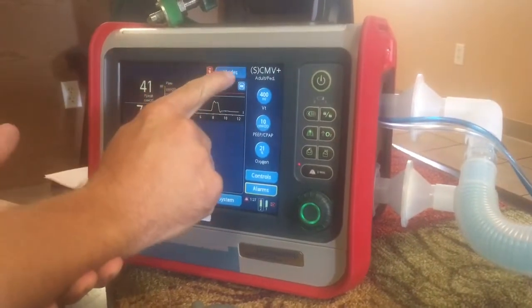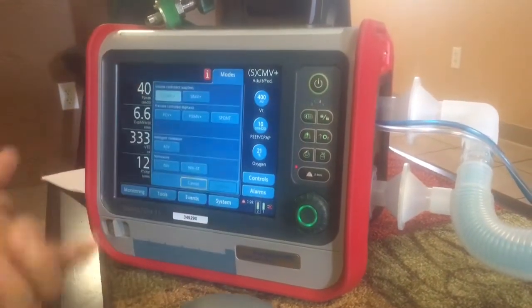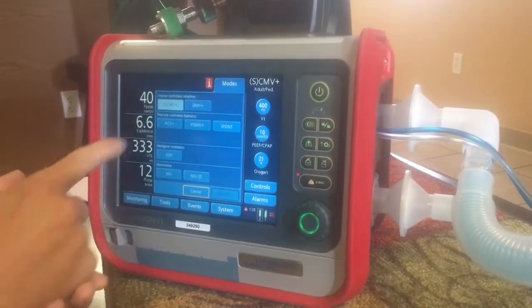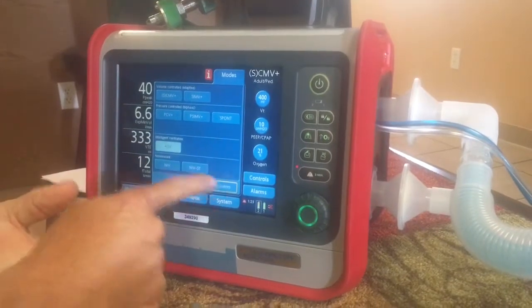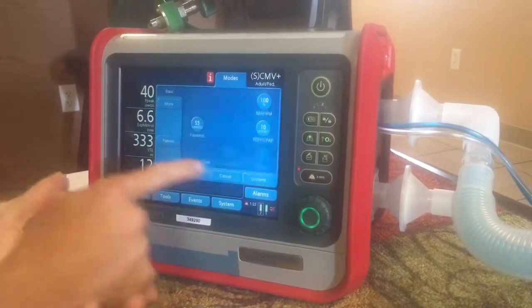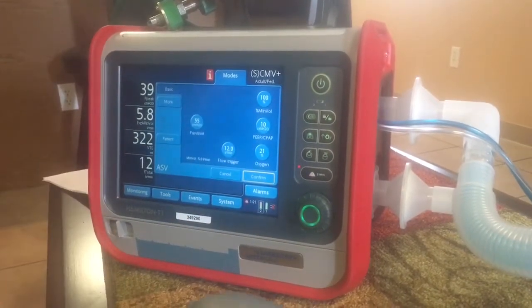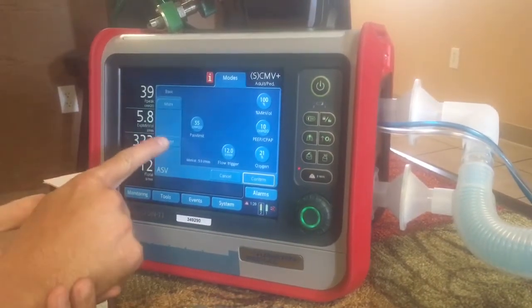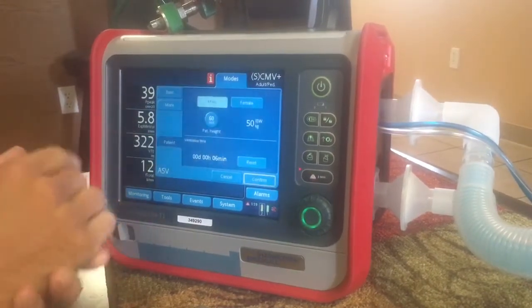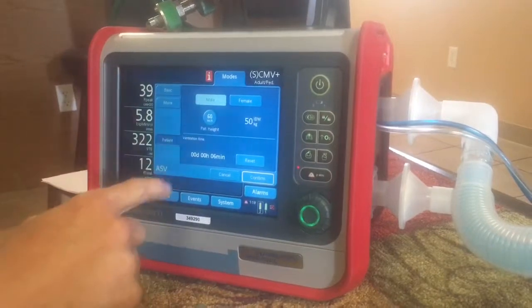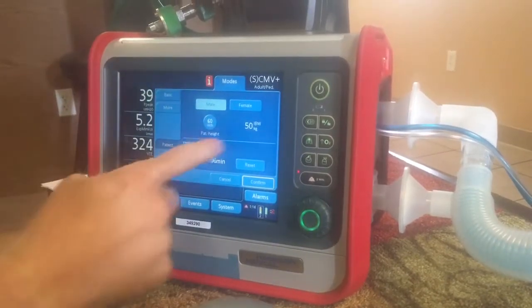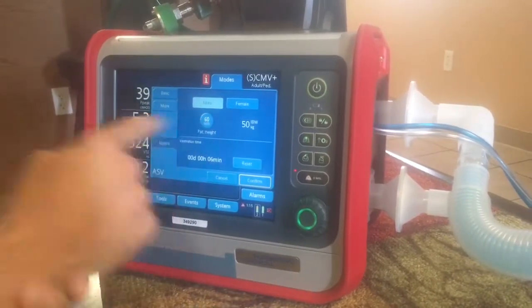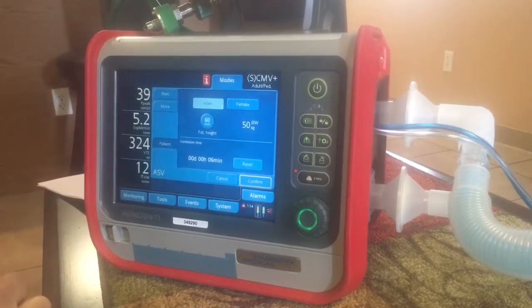Now we're going to switch to ASV mode. We're going to come down here, go to ASV mode, and confirm that. The first thing I want to do is go back to my patient and make sure — this is really important in ASV mode — that you have the appropriate height set.